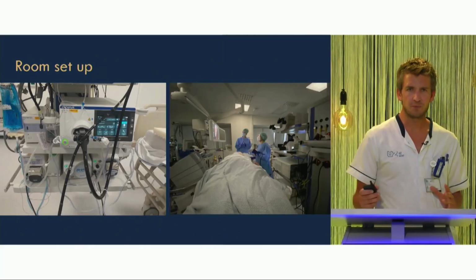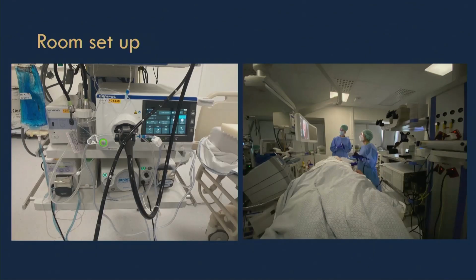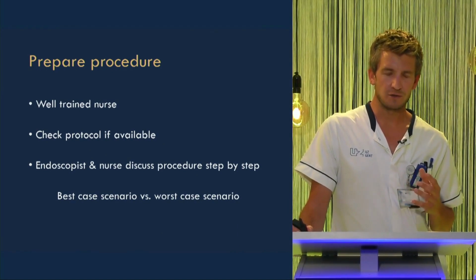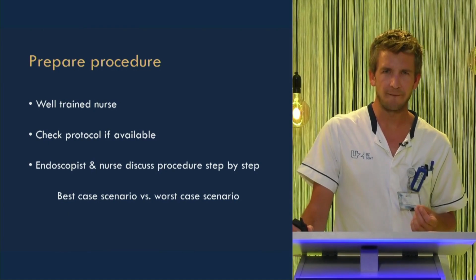The room setup is pretty much the same, but on the left picture you see we have the tissue injection pump of Olympus, and there we use saline again, because the gelofusine is too thick for the knives for tissue injection. To prepare your procedure, to start with, at least you need a well-trained nurse.